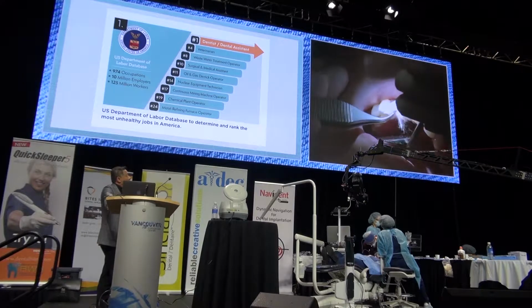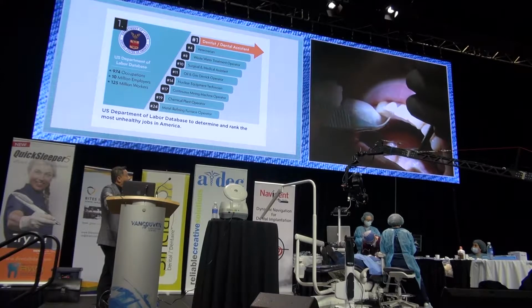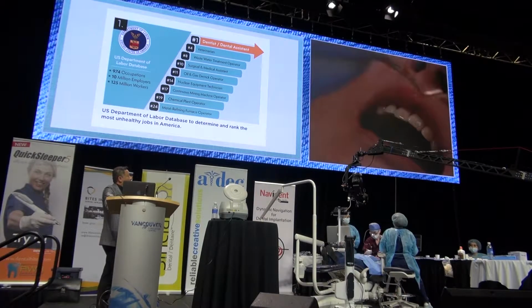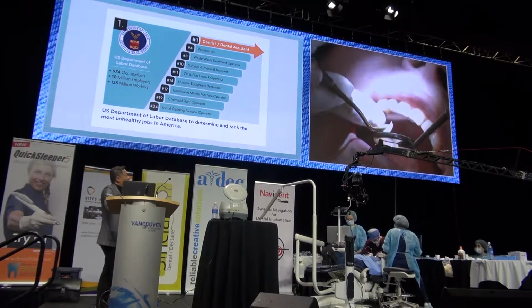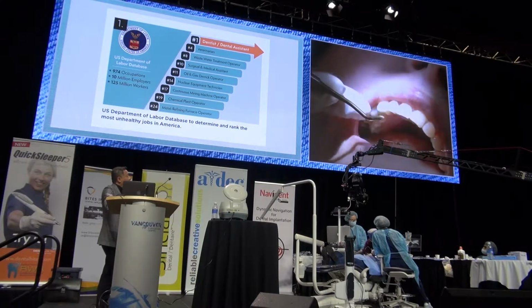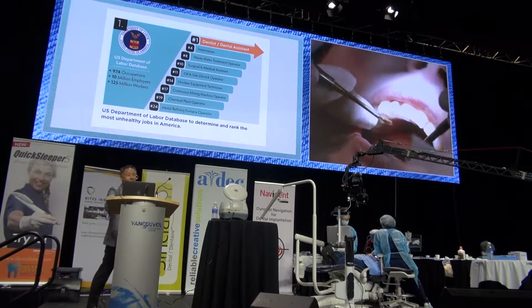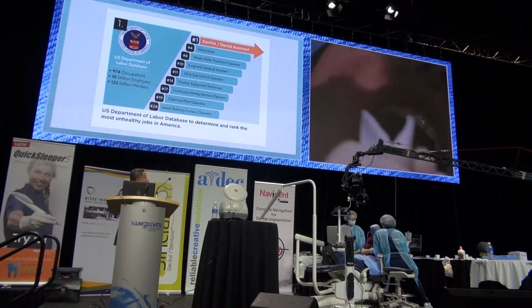So we could use cotton or Teflon tape to protect the screw access hole and to seal the screw access hole. We usually leave this undisturbed for at least 3 to 4 months. And then about 3 to 4 months later, we can get right to the point of unscrewing this, evaluating the emergence profile, and starting our impressions for the final prosthetics, with the benefit of course, developing the other soft tissue profiles.